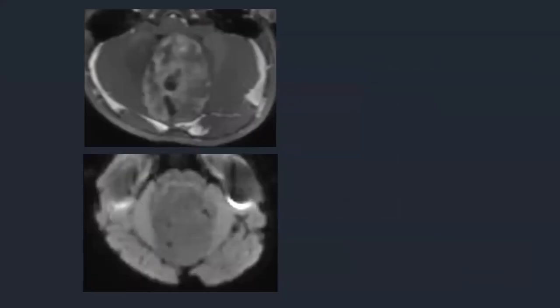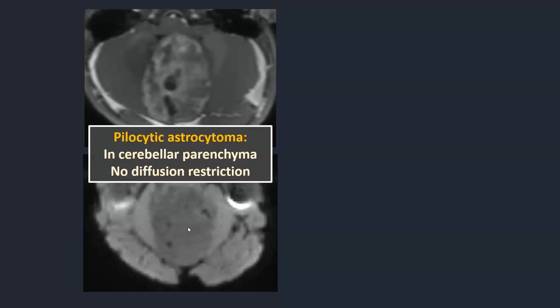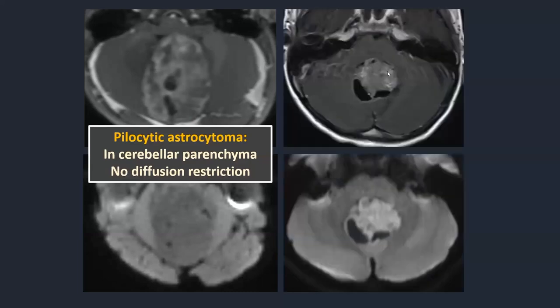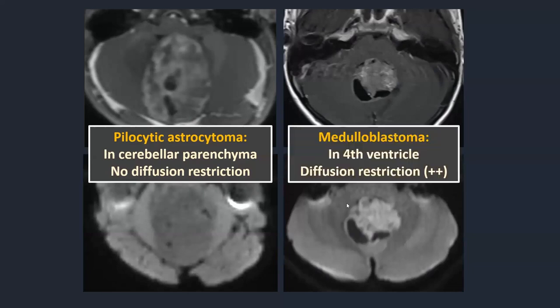Let's compare: our pilocytic astrocytoma patient shows a heterogeneous completely solid mass with no diffusion restriction whatsoever. The medulloblastoma shows an enhancing mass with peripheral cystic components and diffusion restriction. Pilocytic astrocytomas are located in the cerebellar parenchyma and have no diffusion restriction. Medulloblastomas are the classical textbook cases located in the fourth ventricle with diffusion restriction.